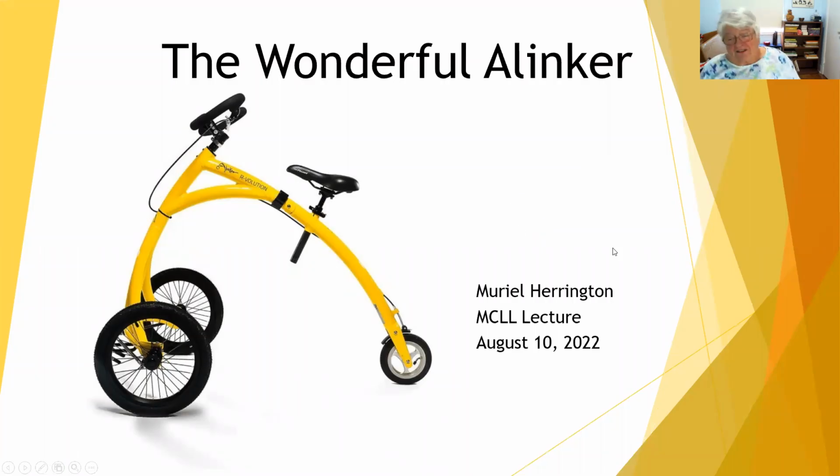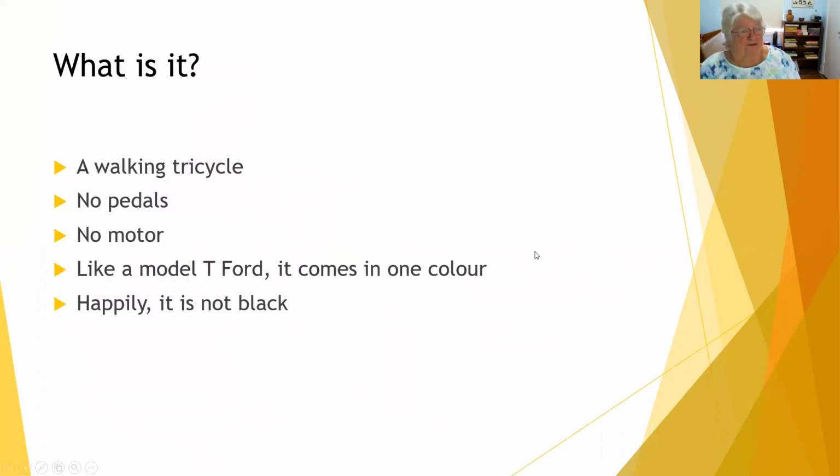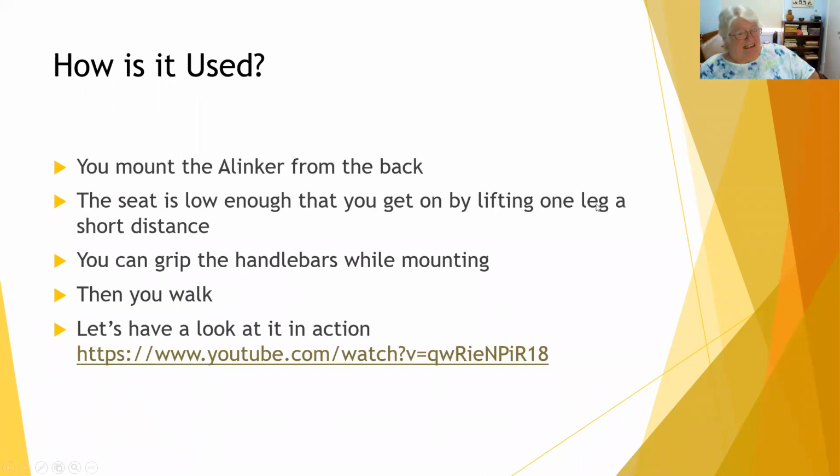I've titled my lecture The Wonderful Alinker because sometimes when I come home after a walk, I say, oh, you're so wonderful, because it really makes a difference for me. So what is it? It's a walking tricycle. There's no pedals, no motor. And like a Model T Ford, it comes in one color. Luckily, it's not black. It's bright yellow, as you saw from my picture.